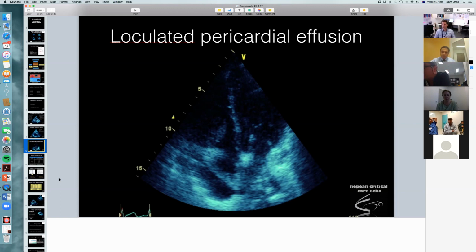And so you would be looking for an increase in the tricuspid inflow velocity of at least 30% after inspiration. Increase of it, yes, very good. And I had a decrease in mitral of 25% with inspiration. Very nice. And why is that? Really nicely done.